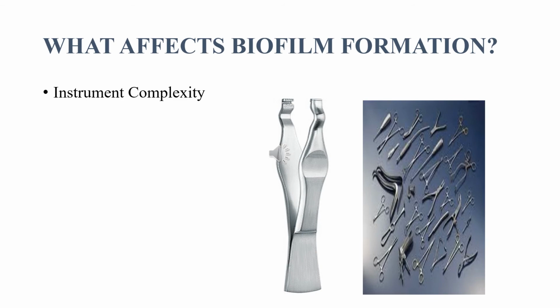On this slide, it shows you the different areas on the instrument that can harbor blood, body fluids, and any other organic type of material. They're very difficult to get to, so that's one of the reasons why we don't want our instruments to dry until we get them to the sterile processing department. So the crevices of the instruments, the pores, edges, any serrations on the instrument, the shape of the instrument, and then lumens are very difficult also to get the blood and body fluids out. And if it dries in there, then it's impossible to remove.